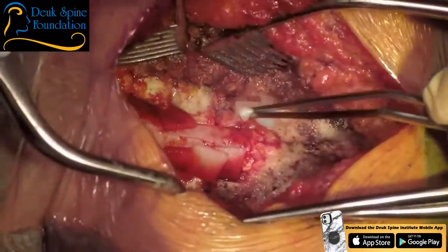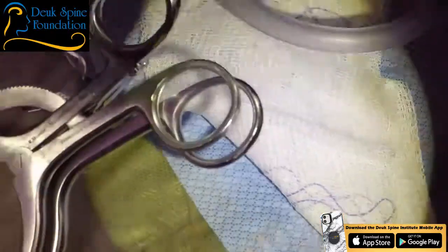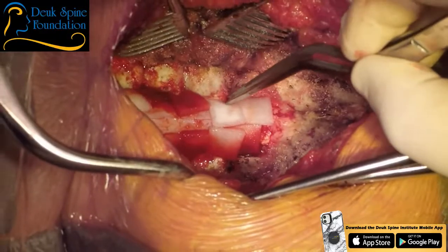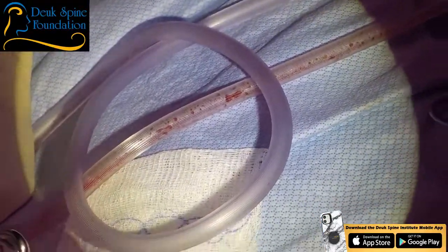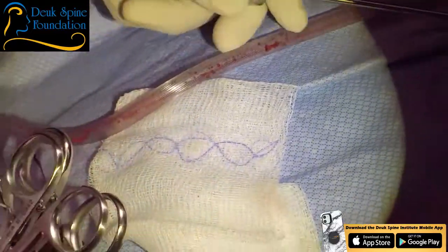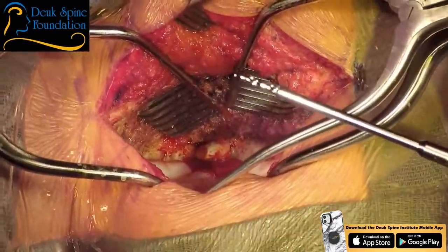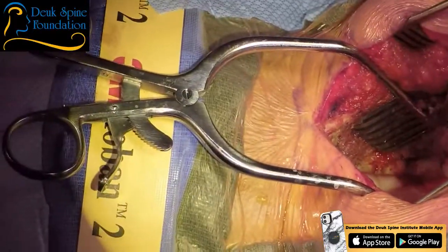Let me get one more. Thank you. Maybe one more after that, sorry. Yep, all right. So, take it. We've finished our exposure. We've finished our decompression. And now we're going to start with our instrumentation. That's where we put screws and rods in.